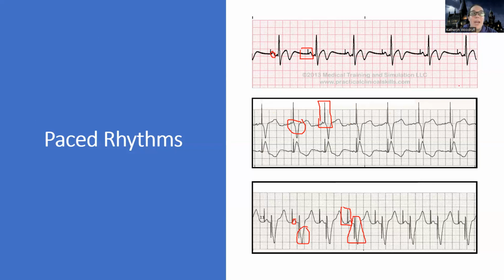You're not going to see spikes on the rhythm because my heart's doing its own thing. There may be times my heart is able to pace by itself. Think of the pacemaker as a backup generator: it comes on when it's needed. If there are spikes here, it means the pacemaker has taken over because the heart is not pacing itself the way it's supposed to.